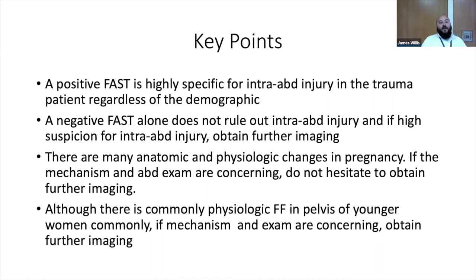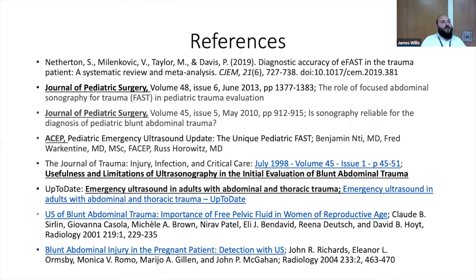Don't stop there. You can definitely perform serial FAST exams for patients with a lower suspicion, and that may be able to reduce the amount of CT scans that you are getting, but if your suspicion is high, scan. And these are my references.